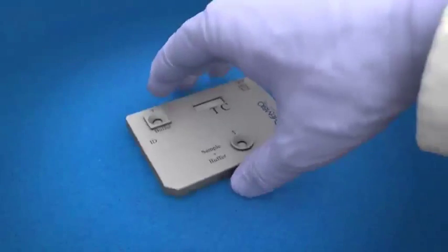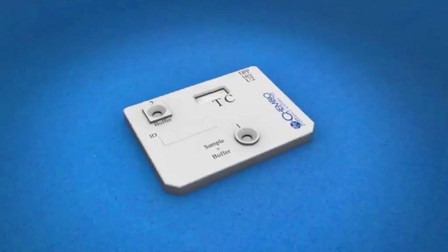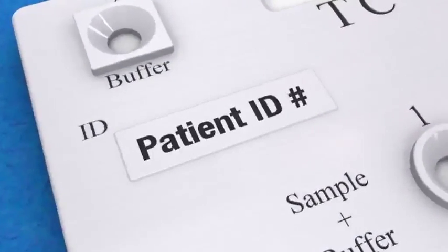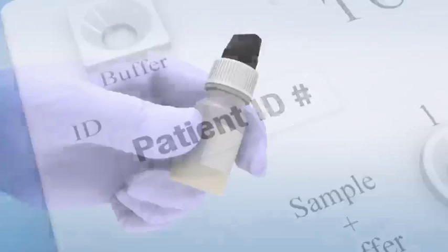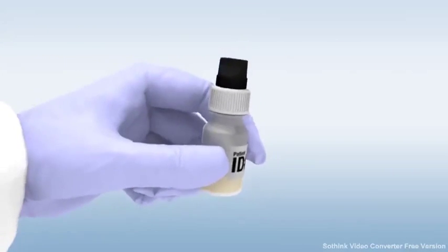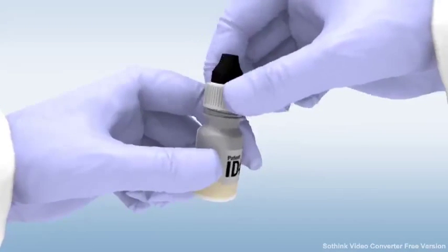Remove the DPP test device from the foil pouch and place it on a flat surface. Label the device with the patient identification number. Label the black cap sample tainer with the patient ID number, then remove the top by unscrewing the white cap from the bottle.